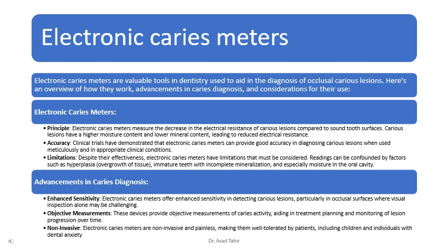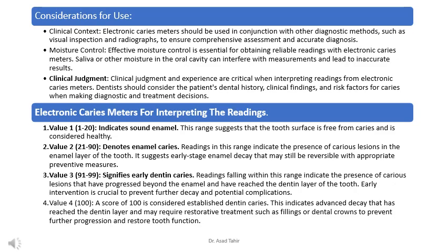Enhanced sensitivity. Electronic caries meters offer enhanced sensitivity in detecting carious lesions, particularly in occlusal surfaces where visual inspection alone may be challenging. Objective measurements. These devices provide objective measurements of caries activity, aiding in planning and monitoring of lesion progression over time. Non-invasive. Electronic caries meters are non-invasive and painless, making them well tolerated by patients, including children and individuals with dental anxiety. Considerations for use. Clinical context.